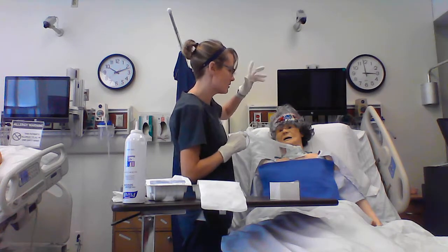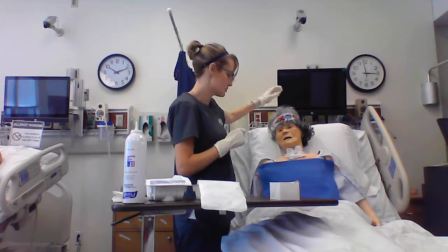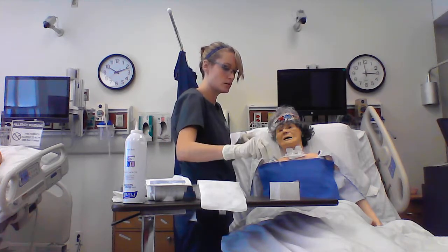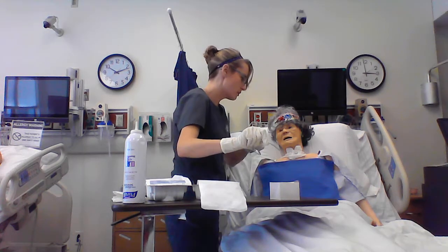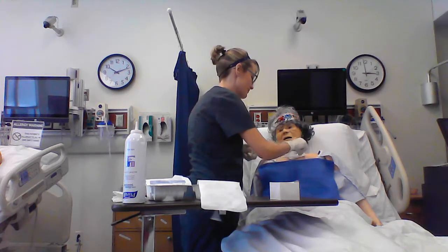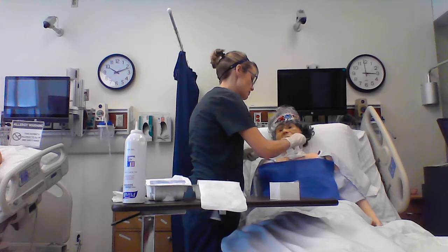I'm also going to take this contaminated hand and remove her oxygen so we can have access to her trach. Test your suction. Lube the tip of that catheter up. Make sure that it's all working. And then we're going to go down without suction. So you meet resistance. And then back up with intermittent suctioning and catheter rotation to manipulate those secretions so that they come loose.